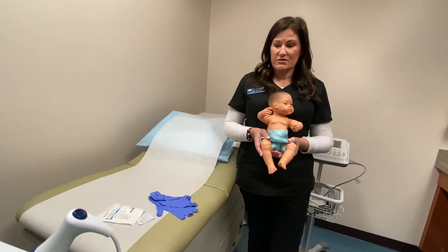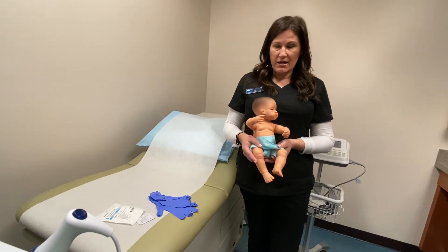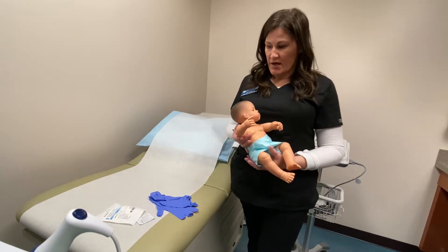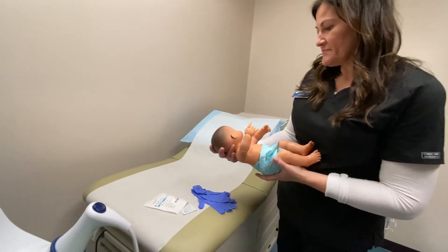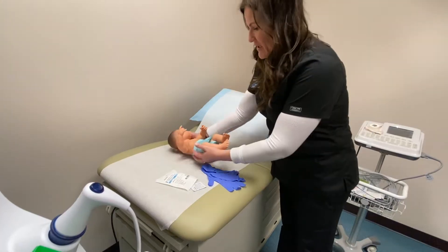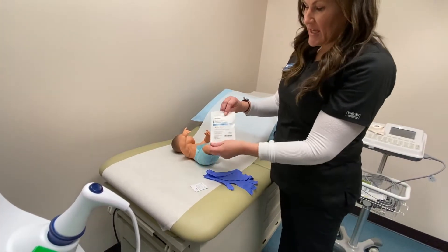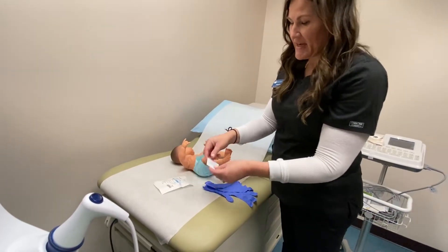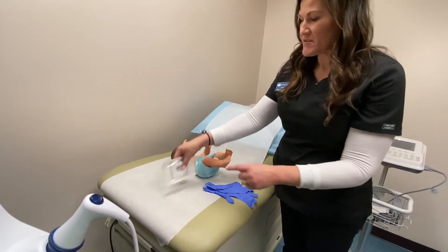Hey everyone, it is Professor Lee. I'm going to show you how to put a urine collection bag on an infant or a baby who is still in diapers. We have our little baby here, and you're going to need a pediatric urine collector. This one is a little bag — sometimes they're cups, but most of the time they're in these little bags.